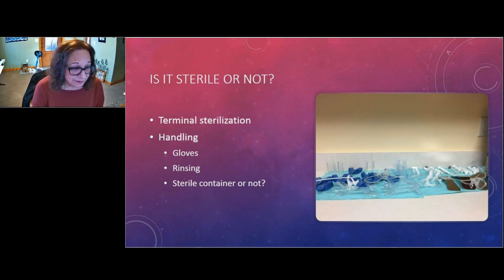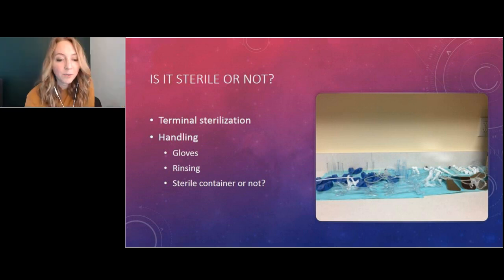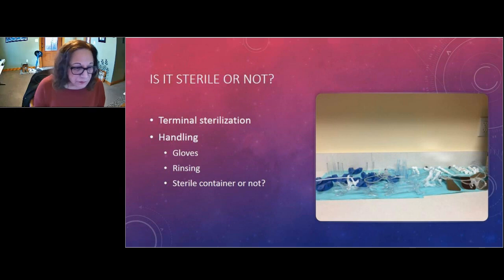Okay. This question says, what is the difference between cold sterilization and high-level disinfection? And if they're the same thing, why the difference in terminology? Okay. I tried to make that point when we first started. The main difference between cold chemical sterilization and high-level disinfection, generally speaking, is timing.